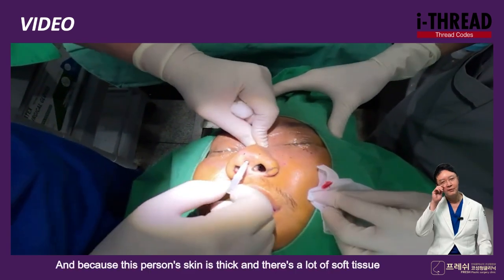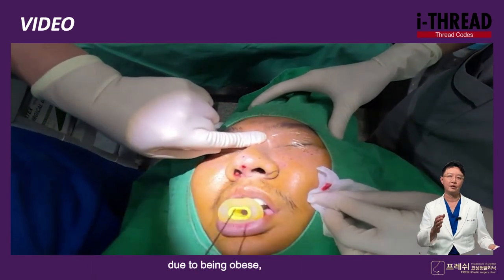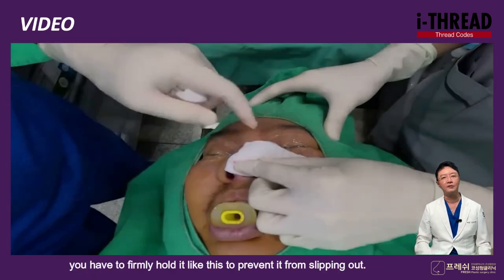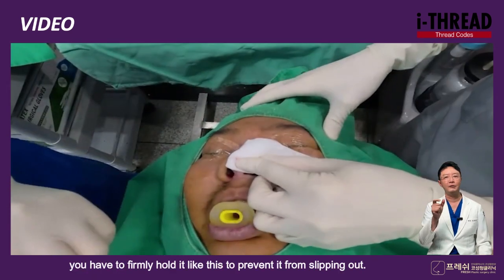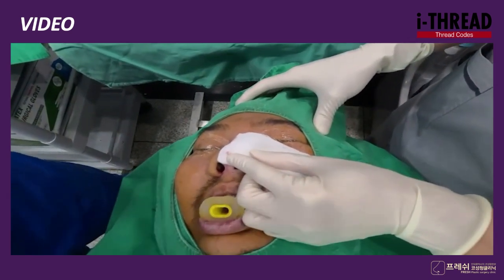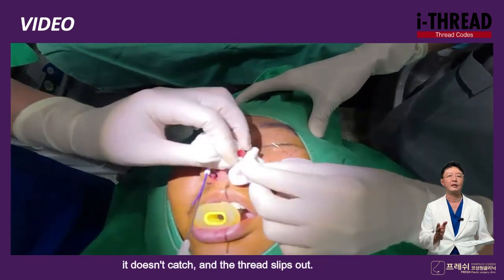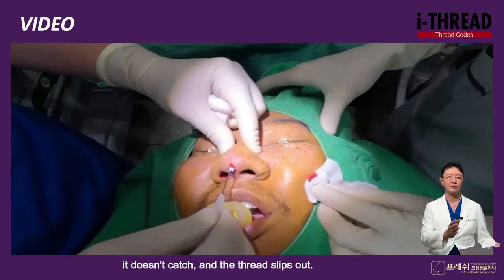And because this person's skin is thick and there's a lot of soft tissue due to being obese, you have to firmly hold it like this to prevent it from slipping out. If you just do it normally, since there's no bump, it doesn't catch, and the thread slips out.